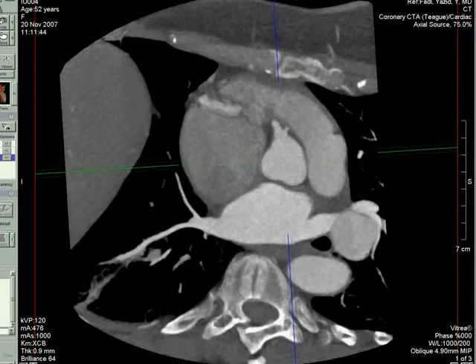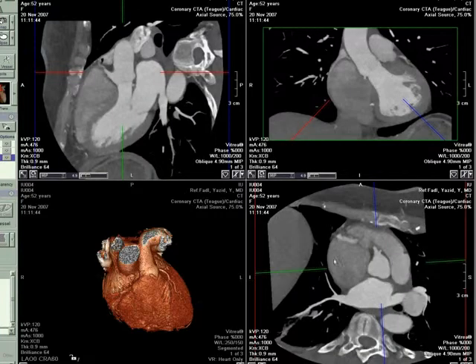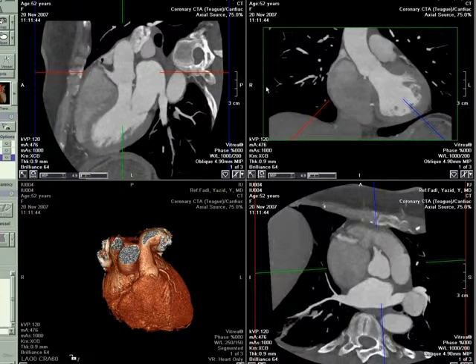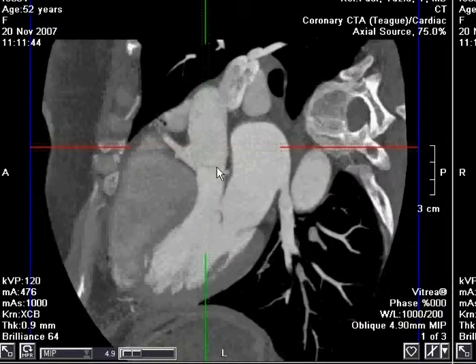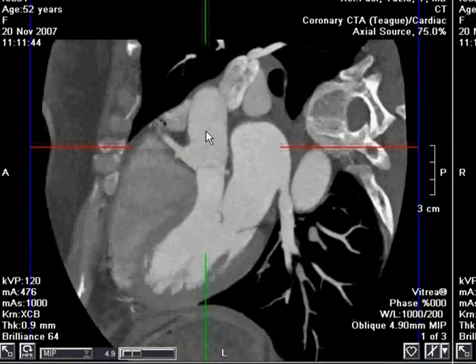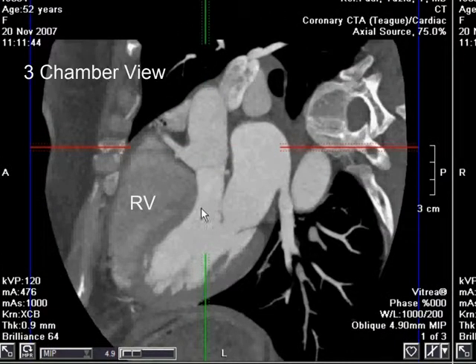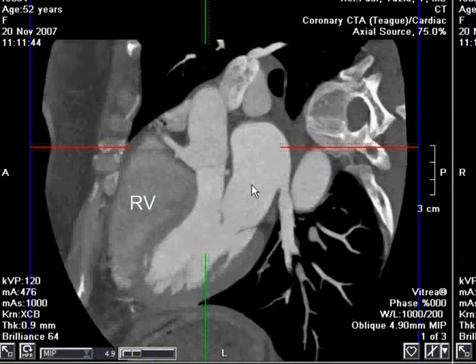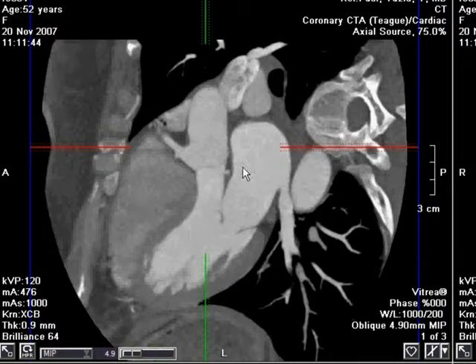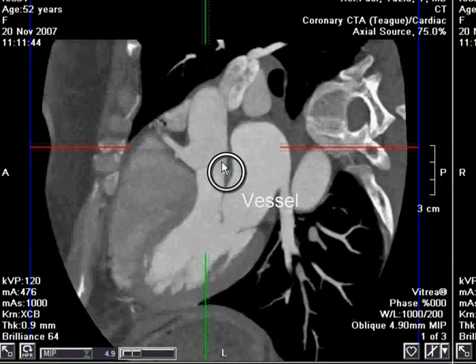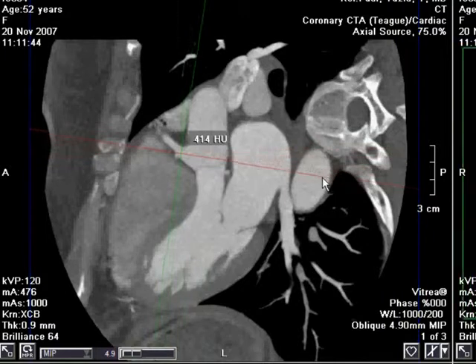So let's see if we can see it even better by concentrating on the image right here. You can see this is a three-chamber view — the left atrium, left ventricle, aortic root. This is a vessel that's retro-aortic, posterior to the aortic root here.